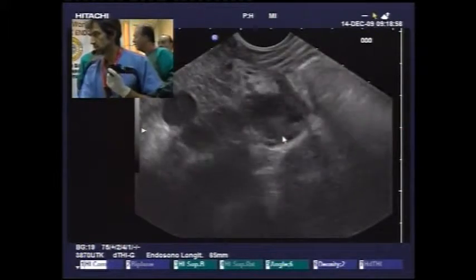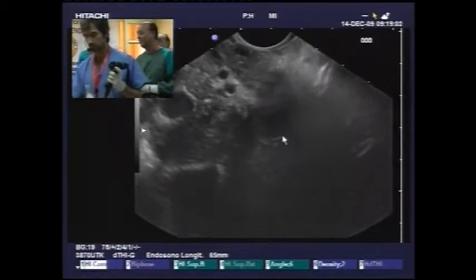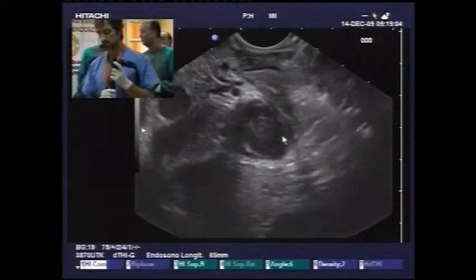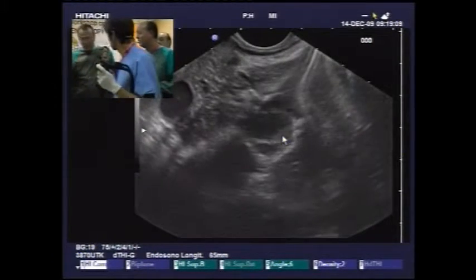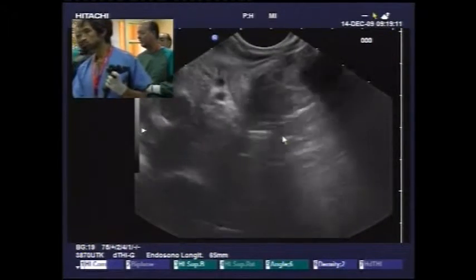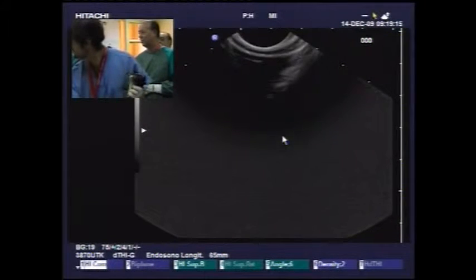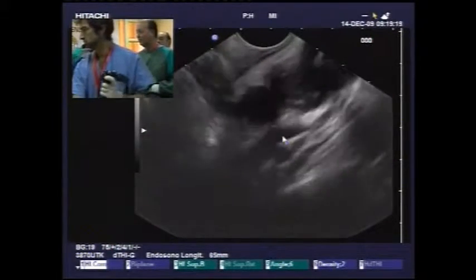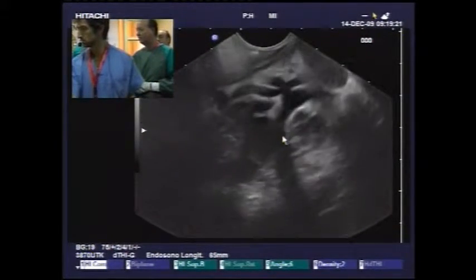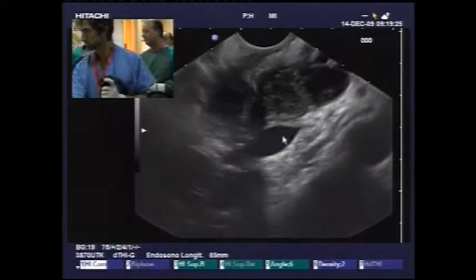I don't know if this patient could be in Europe. I think that the main is lymphoma. I think also at this age, lymphoma is the commonest. There are some other causes of lymphadenopathy, but not this size, and it is not caseating or something. So I think the first possibility is lymphoma.